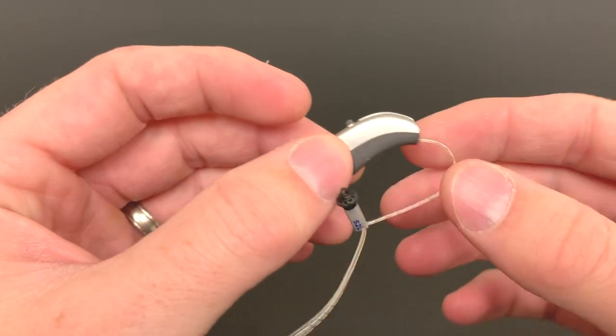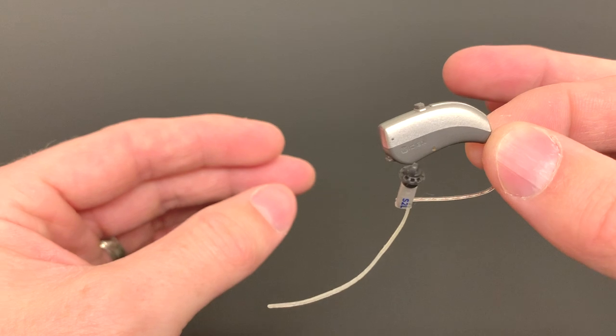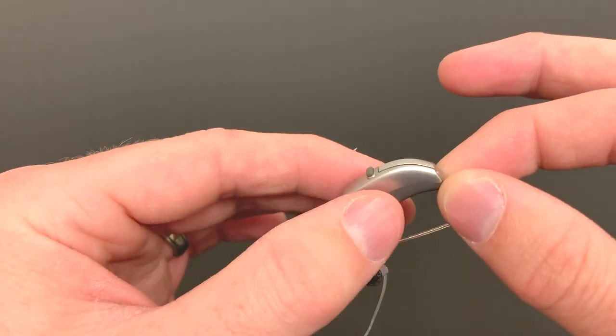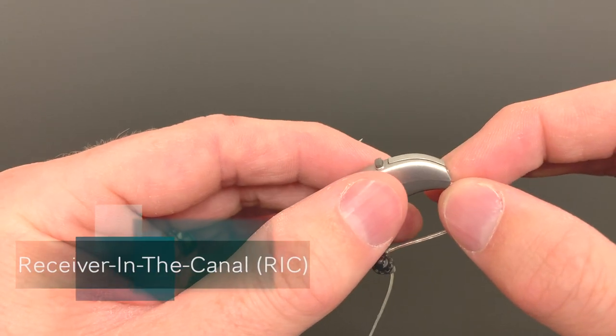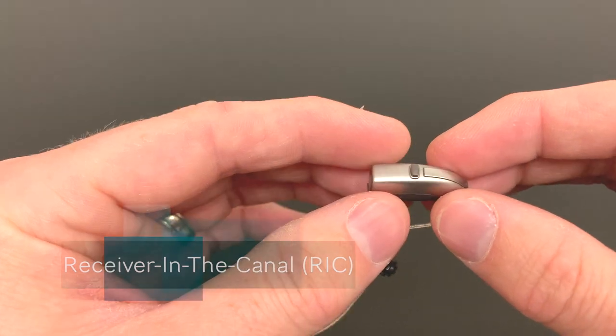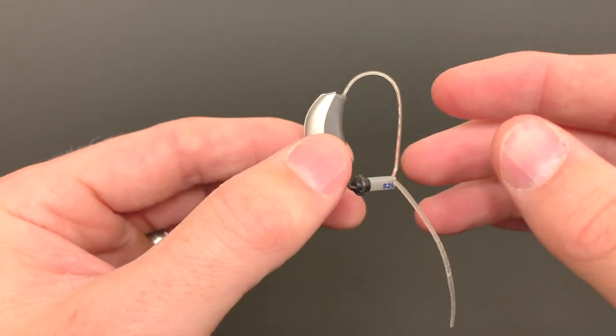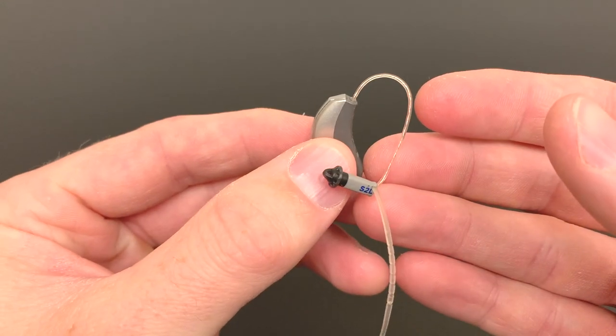So the first style of hearing aid I'd like to talk with you about is a receiver in the ear or receiver in the canal, or you might hear it referred to as a RIC or a RITE. This is a pretty common style of hearing aid that you see on the market.